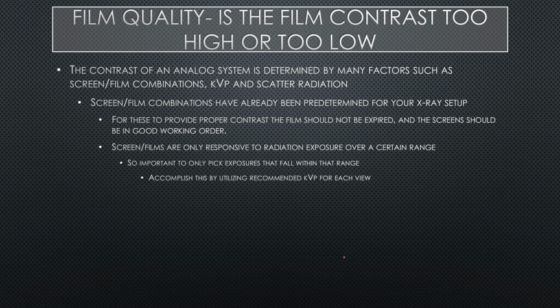Proper screen film combinations are only responsive to radiation exposure over a certain range. So you have to only pick exposures that'll fall within that range. And again, proper kVp should be utilized.